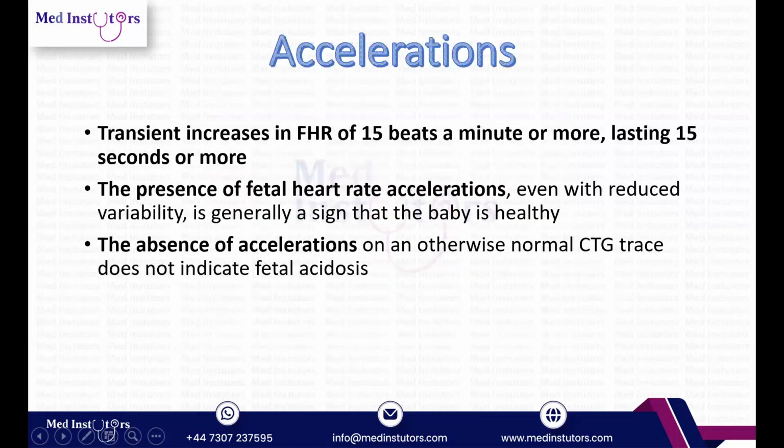Then let's talk about accelerations. An acceleration is a transient increase in fetal heart rate of 15 beats per minute lasting for 15 seconds. The presence of fetal heart rate accelerations, even with reduced variability, is generally a sign that the baby is healthy.